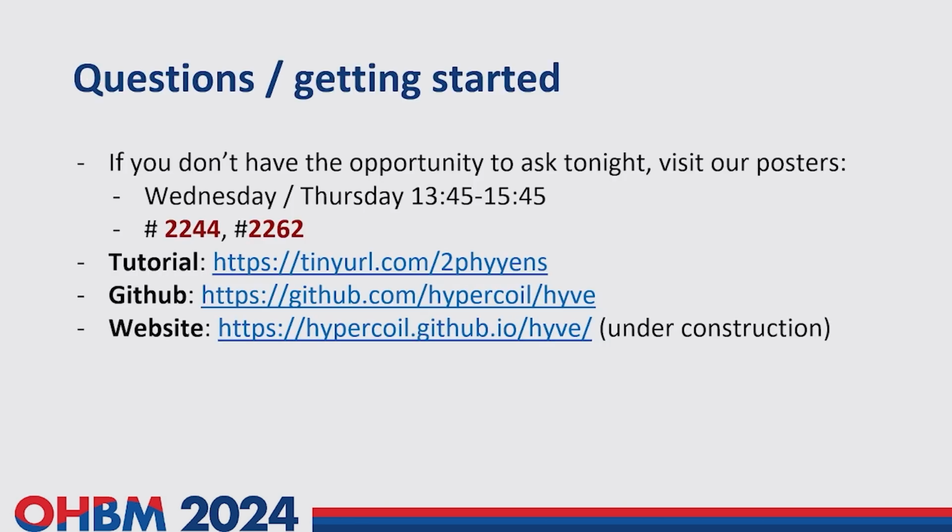So feel free to reach out if you have any questions, if you'd like to become involved, if you have a use case that you'd like to discuss. We'd love to hear from you and to get more people involved in this. There's a link here and on our poster for a tutorial that you can try out. It's a Jupyter notebook that basically walks through a constructive example that builds up increasingly advanced visualizations by composing primitives progressively. Yeah, and I'll open the floor to questions now.